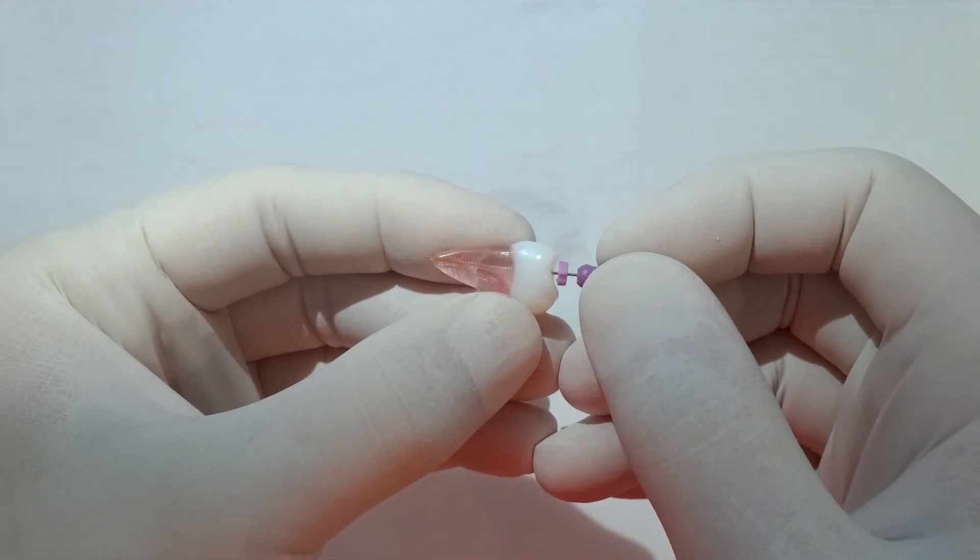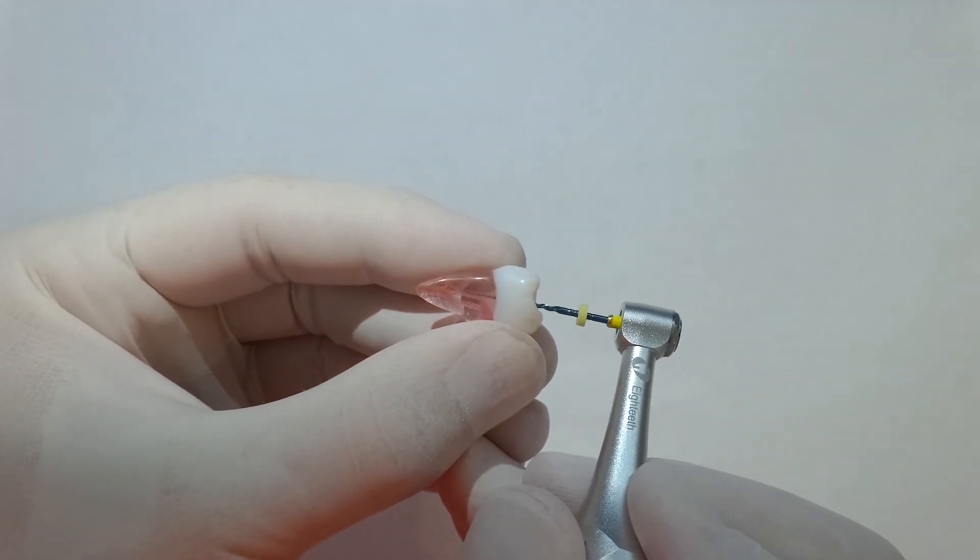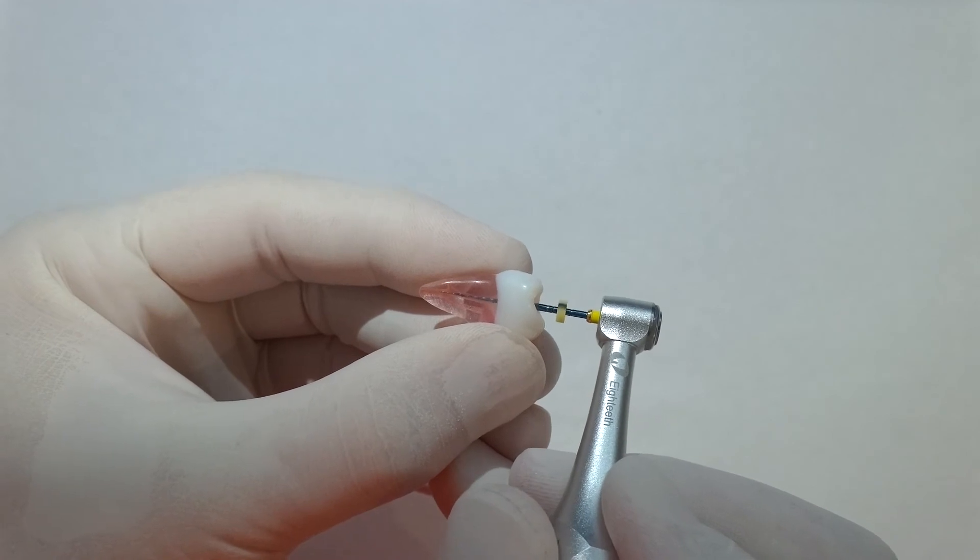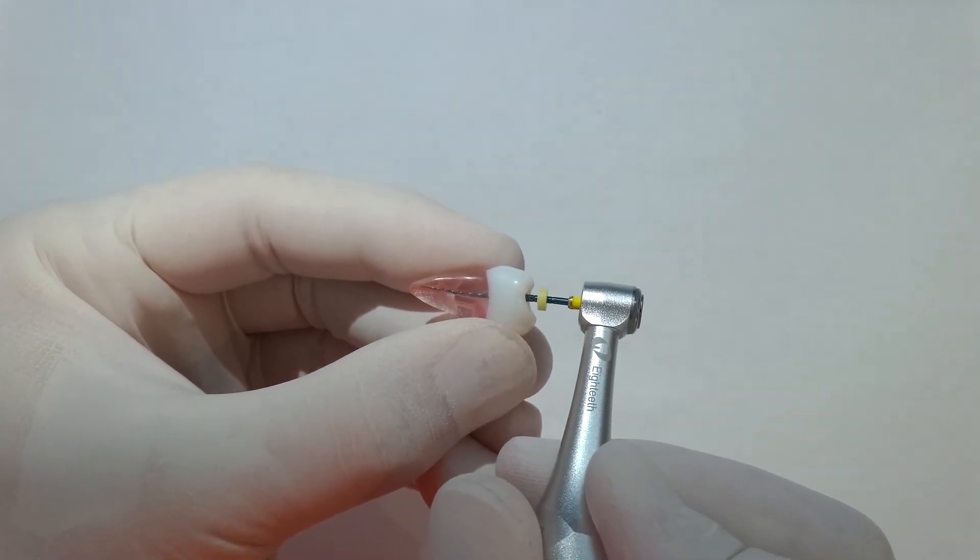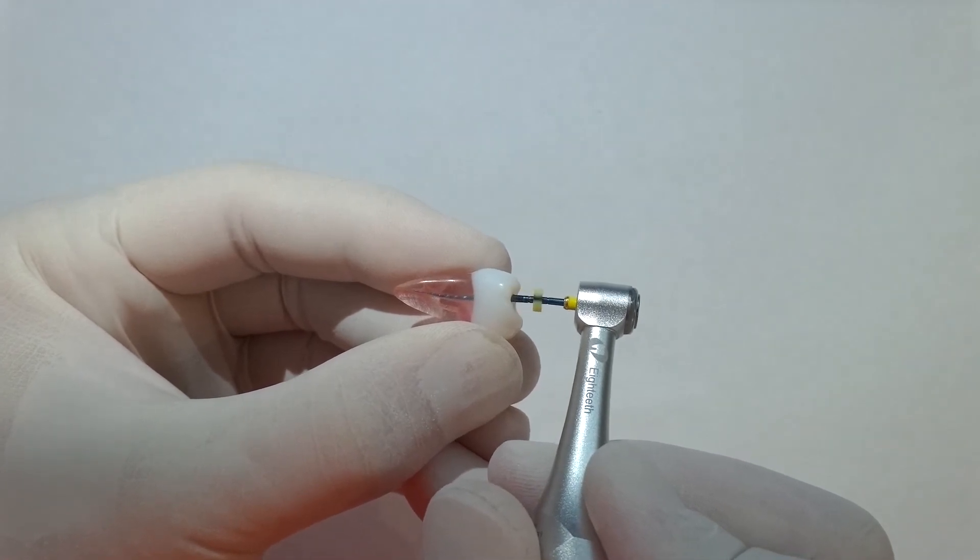Then in with our first finisher file, this is the F1, this is a 2007. A bit less brushing here with this one, it's just more of a peck, because this is just going to shape that final little apical portion. Here you can see that goes to length really nicely.